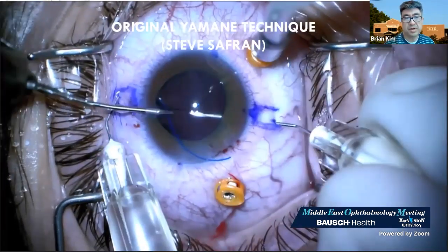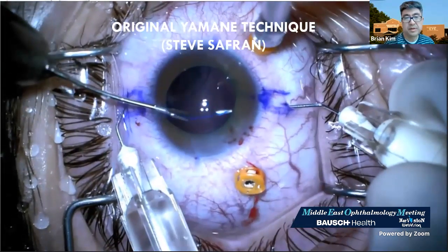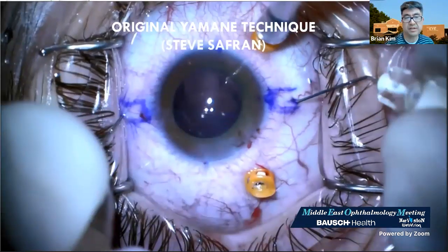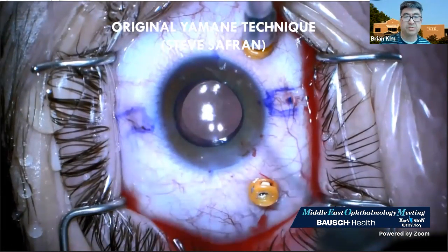And then through a paracentesis contra-incisionally, he's going to place the haptic into the needle. And he externalizes both haptics simultaneously, as Dr. Yamane does, and cauterizing the tips, creating a small flange, and then repositing the haptic into the sclera.